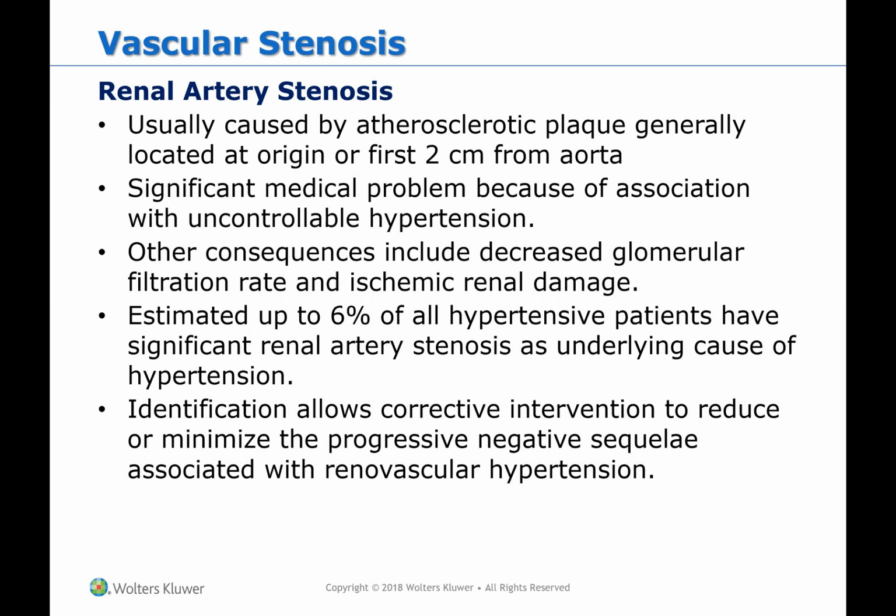studies on an abdomen, because you're dealing with a lot of bowel gas and you're dealing with patients' body habitus. So a lot of the times if a patient has a larger body habitus, it's difficult to penetrate enough to really examine and evaluate the renal arteries how we should.